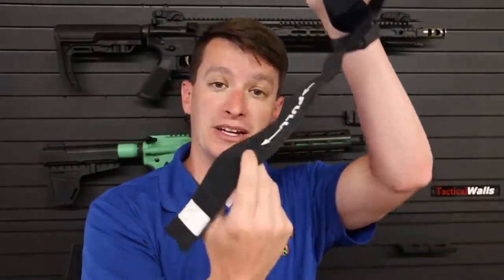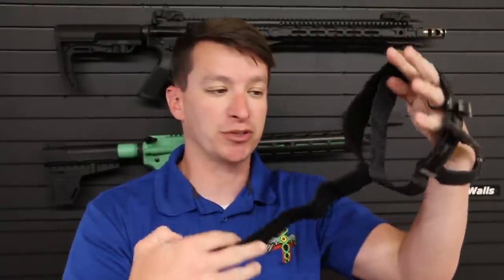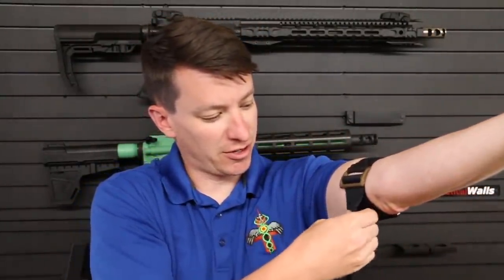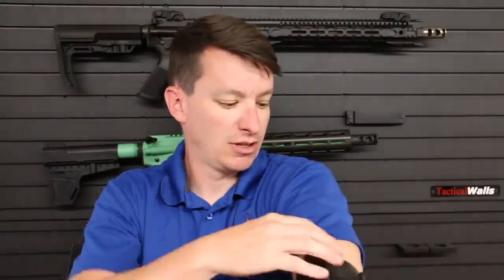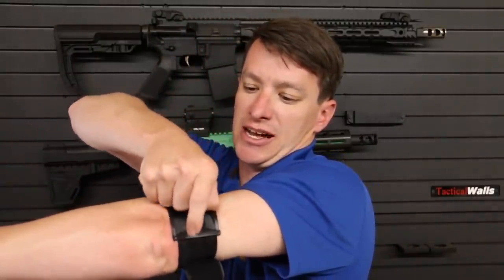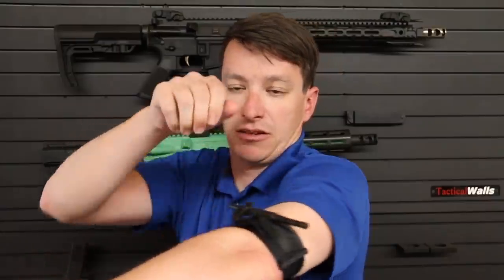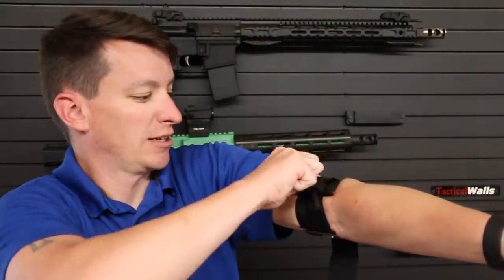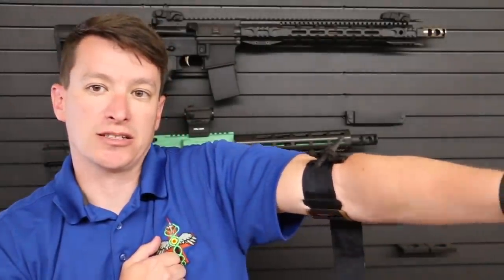For self-application, pull this band towards you — there's an arrow pointing towards you. Slip it on, pull it tight, feed the Velcro around, and turn the windlass until the bleeding stops. When you're done, it secures and locks in place.